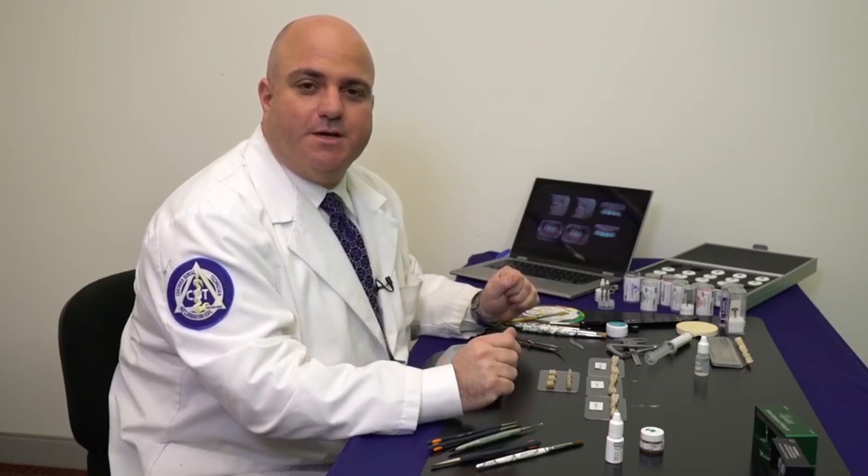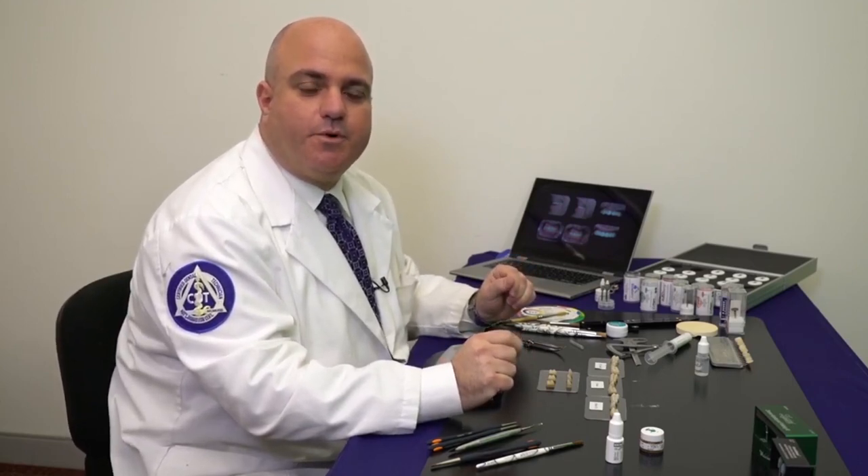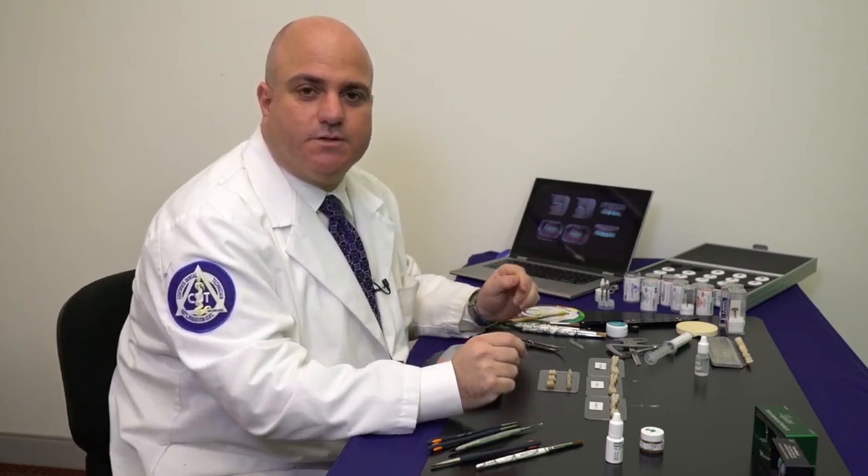Hi everybody, how you doing? My name is Daniel Alter and I'm here to show you some techniques of how to properly stain and glaze to get the best aesthetic results.